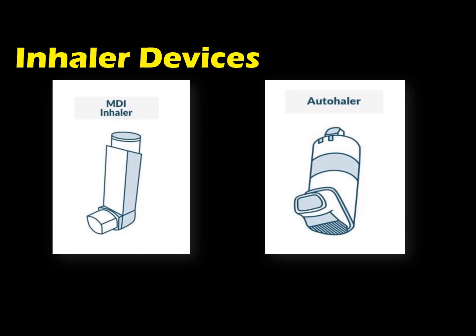However, the use of MDI will also have its own disadvantages, and this would include the need for correct actuation-inhalation coordination. This is a device that requires experience and repeated use so that it would be properly used, and there's a little bit of difficulty compared to the other types of inhaler. It has a tendency for oropharyngeal drug deposition because of how fast the delivery of the medication is, and there's possible flammability because of the hydrofluoroalkane propellants used in the manufacture of MDIs.